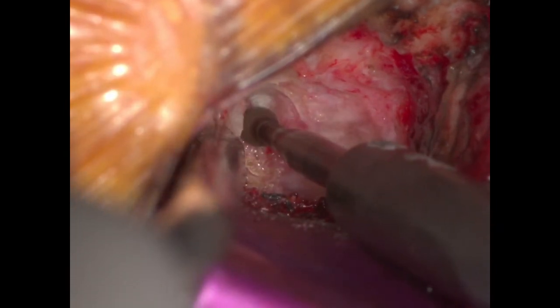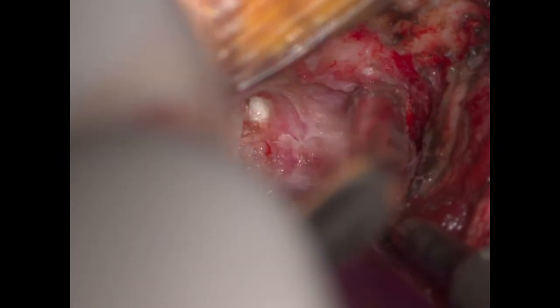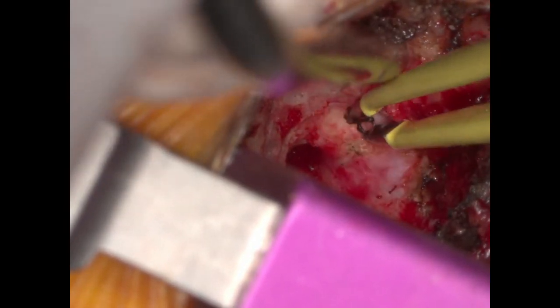We now proceeded even more deeply, immediately ventral to the spinal cord. You can see that just to the right of the drill the bone is very thin and the epidural venous plexus is just visible. Using a small curette, the residual bone is removed at this thinned-out portion.